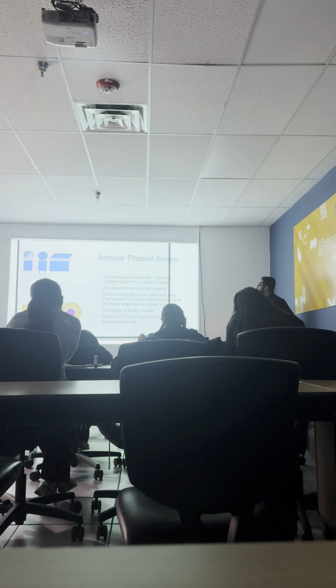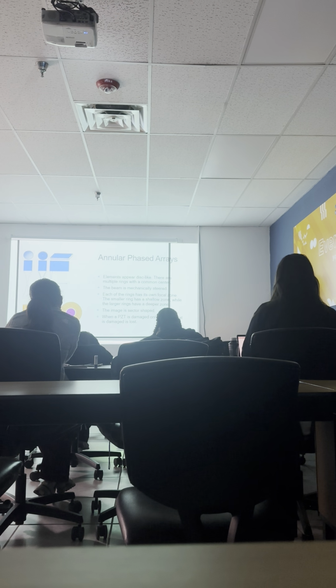So when a PZT is damaged, only the area where that PZT is working is affected. So again, it would look like a dark line.